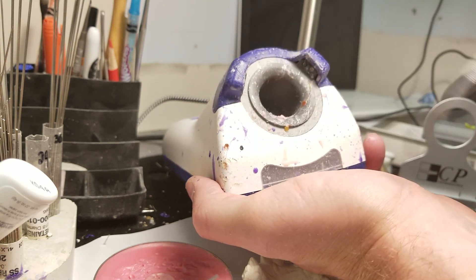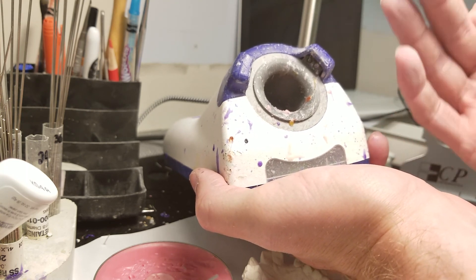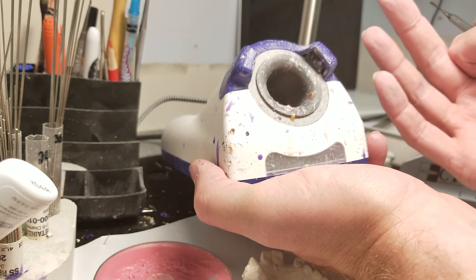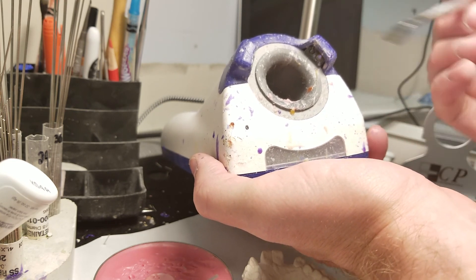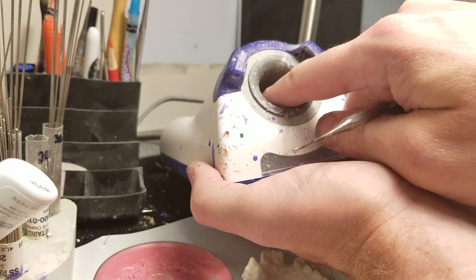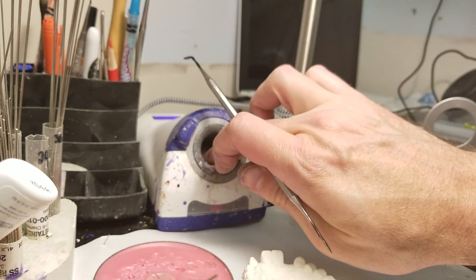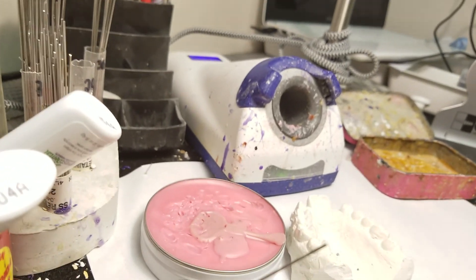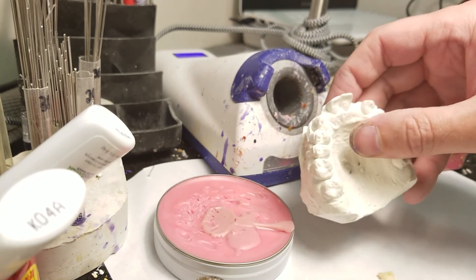The sensors detect when something enters into this chamber and it turns on the induction system. In layman's terms, think of induction like radio waves that only affect metal. So you can stick a metal instrument in here and it'll get hot, but you can stick anything that's not metal in and it doesn't harm you — I get no heat at all.